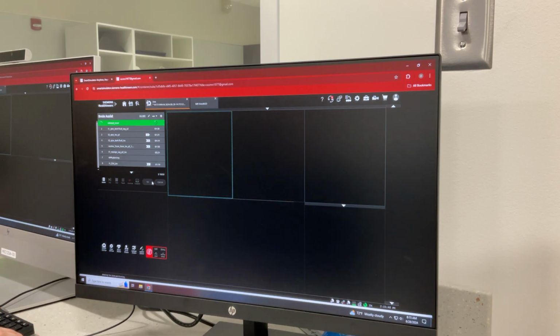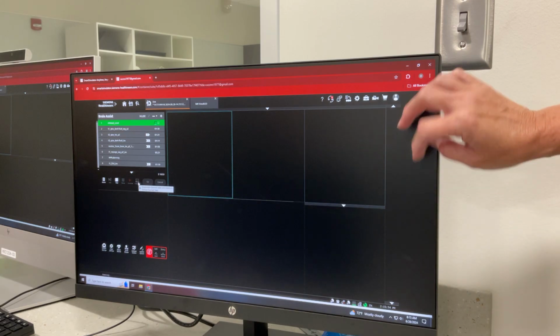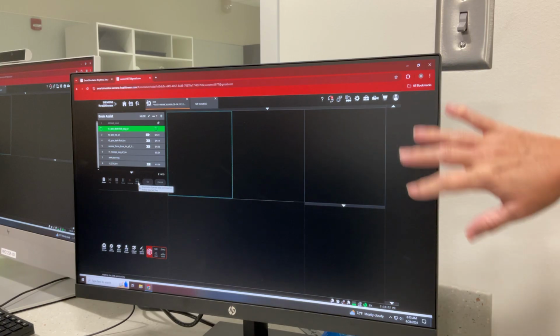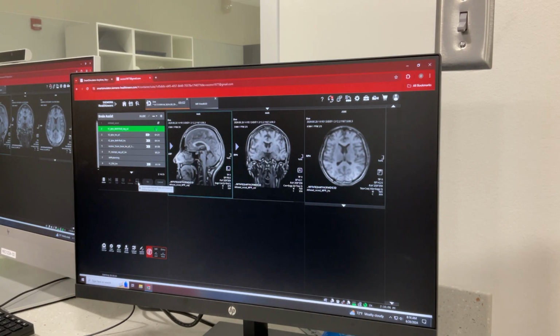And that's just going to run, and then it's going to populate images over here that we can scroll through. So remember how last week, like the sagittal, we only had one image, we couldn't scroll through it. So now we're going to have some images that we can select over here to scroll through to set up our planes and then go through some anatomy.